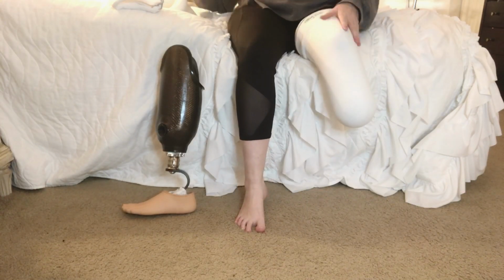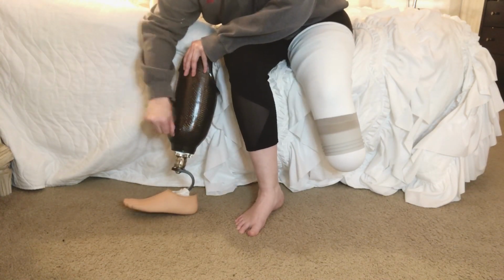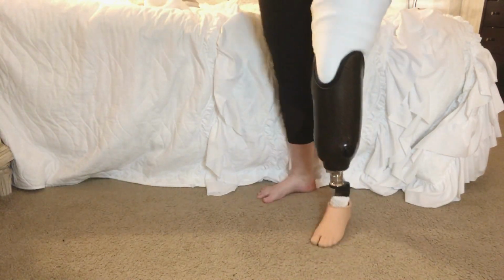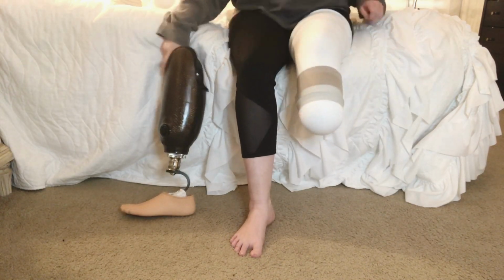I have to figure out how to get my leg to stay on. This is incredibly frustrating. I don't even know what combination to do right now. I have on 9-ply and my thickest ring, and I still can't get it to stop losing suction. Like, it's making my eye twitch.